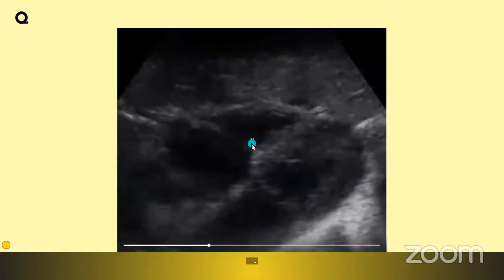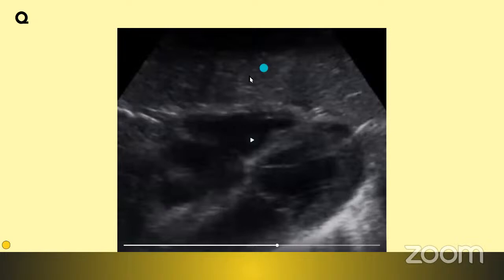If you see here, let me show the atria and ventricles. Okay, good. So these are the ventricles. Fine. Left ventricle, right atria, and left atria. Fine. Any other doubt? Is the doubt cleared, Deepak?